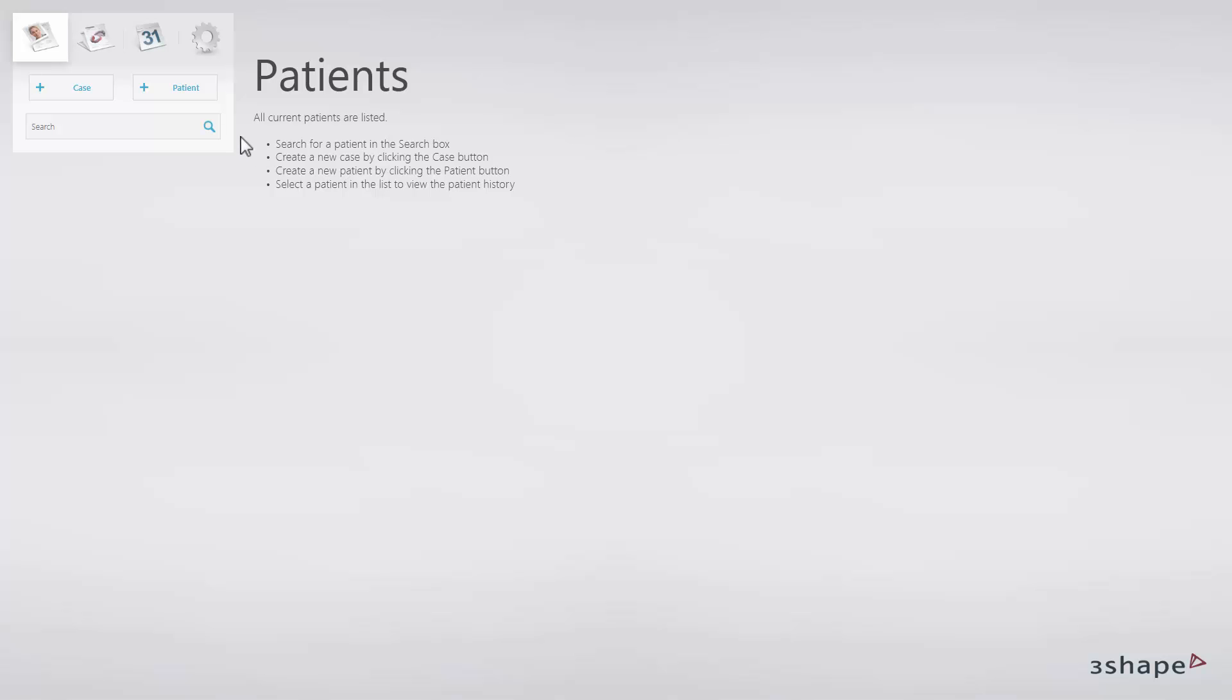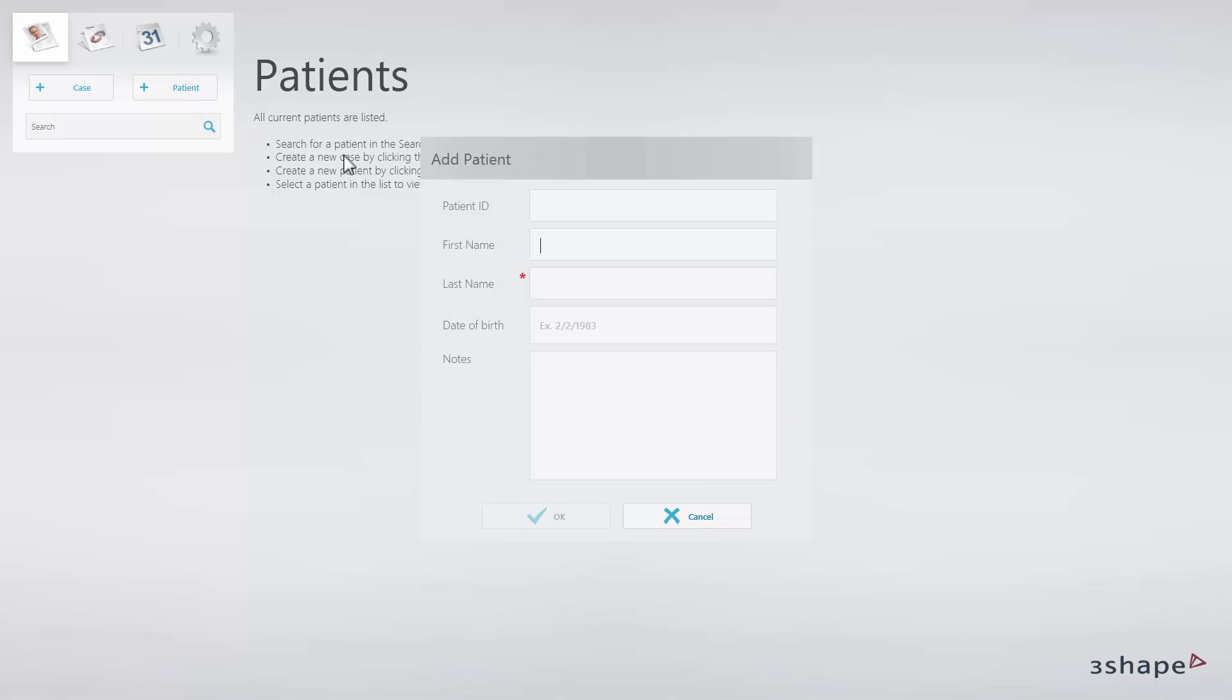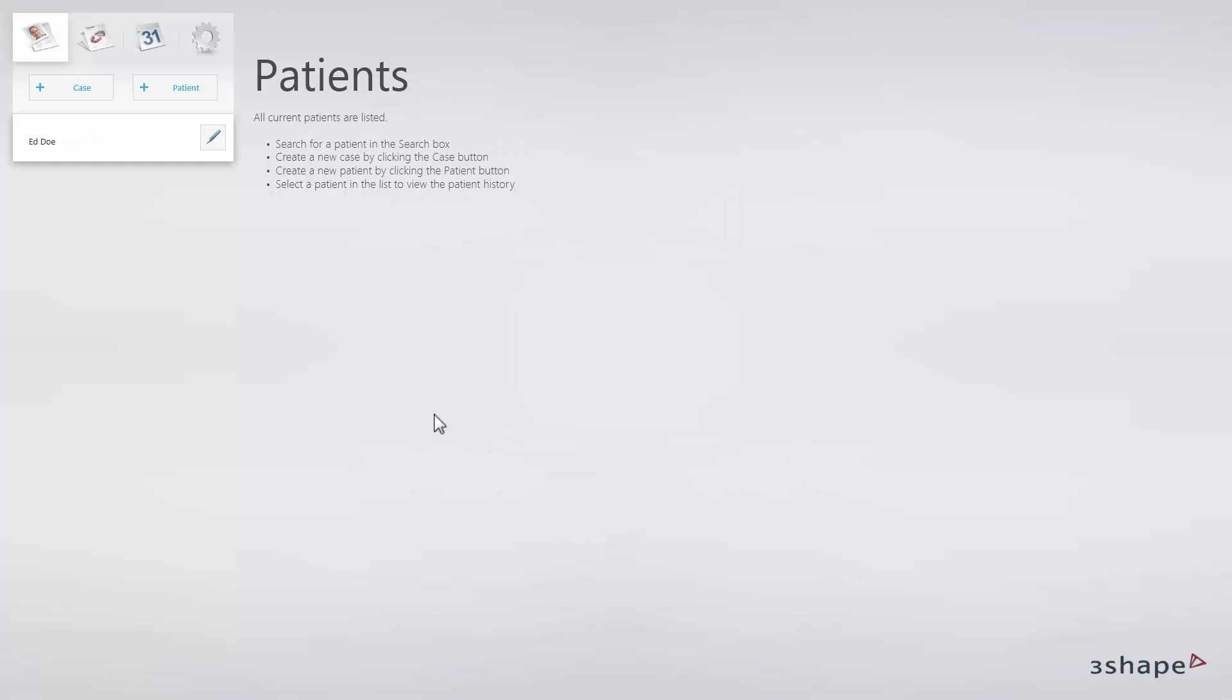To create a new patient, click Patient. Please fill out the required fields and click OK. The patient list will appear in the upper left corner.